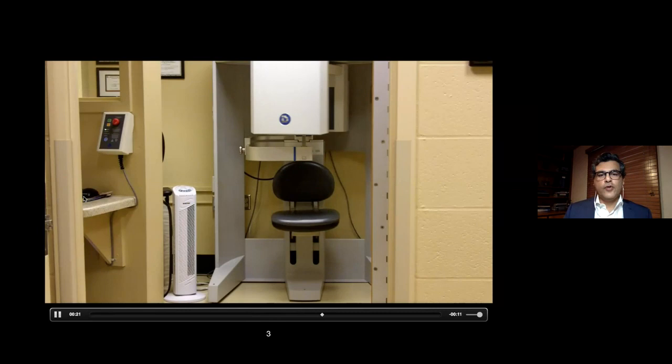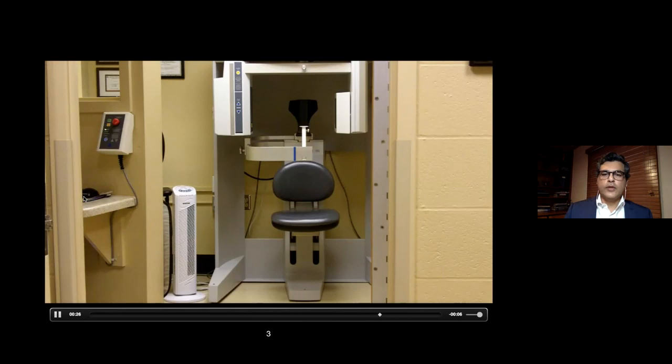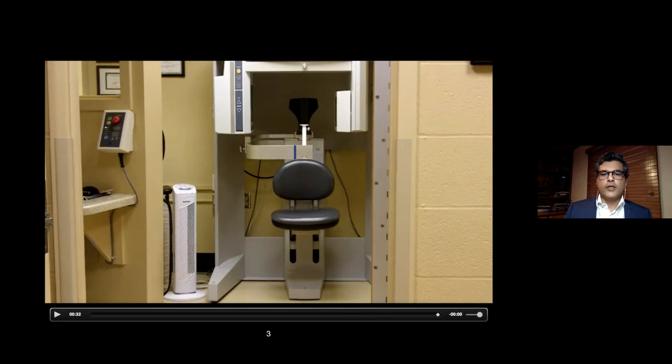It's really amazing if you come to think about it. You are scanning the three-dimensional anatomy of a patient in about 12 seconds with a significantly lower radiation dose compared to other imaging modalities which can give us a similar kind of information.